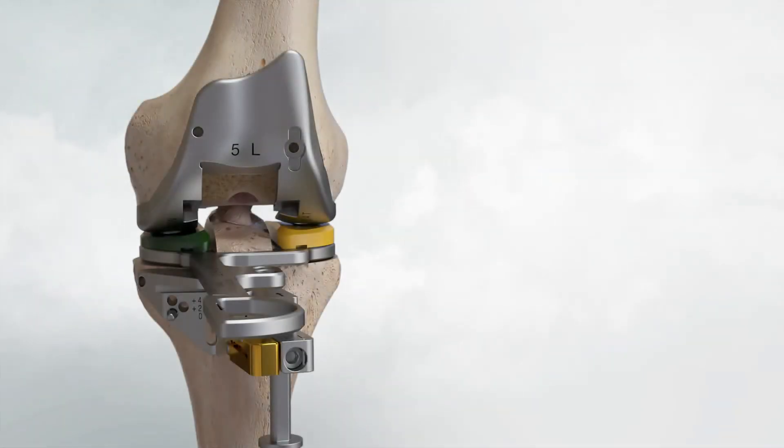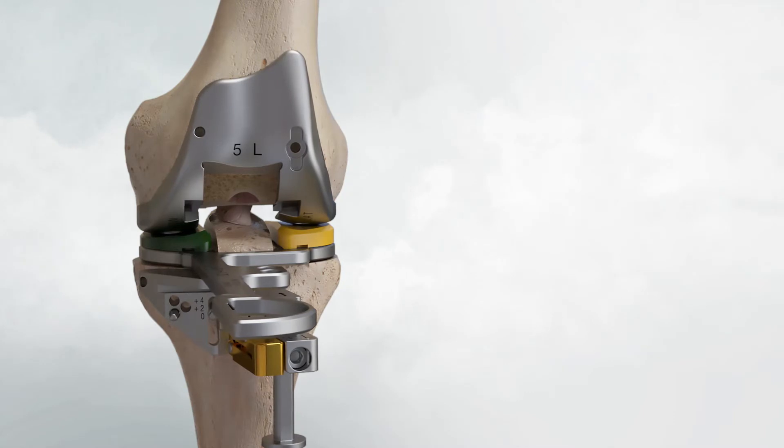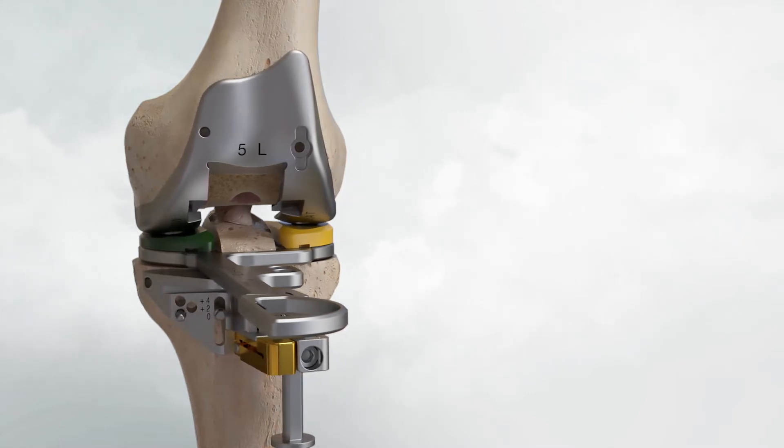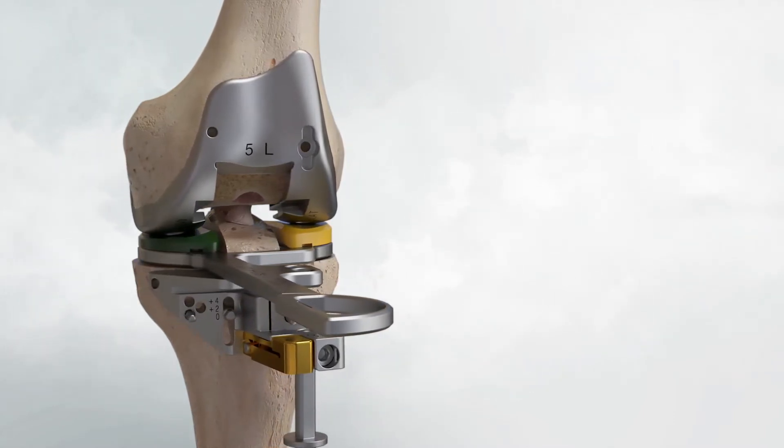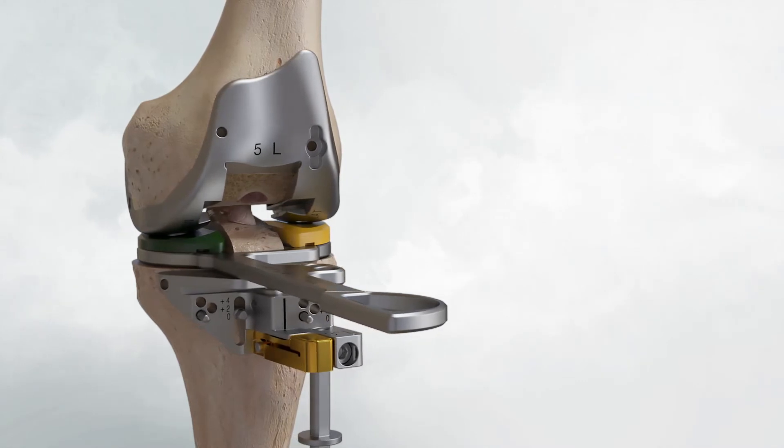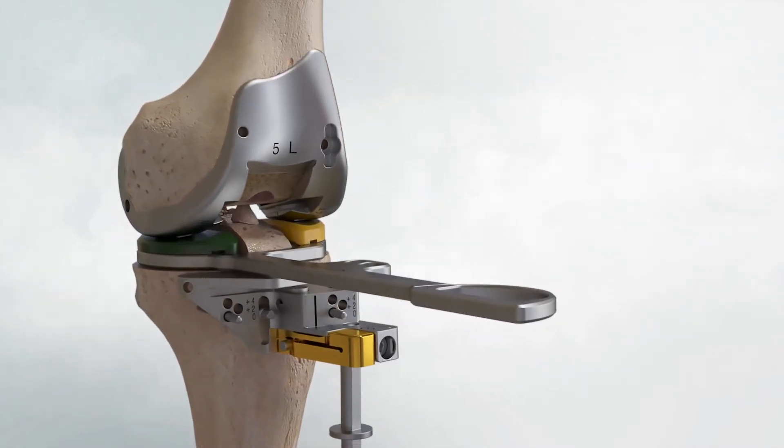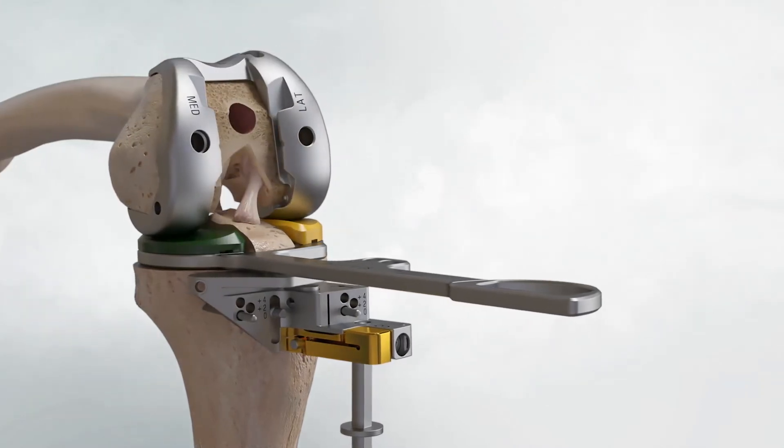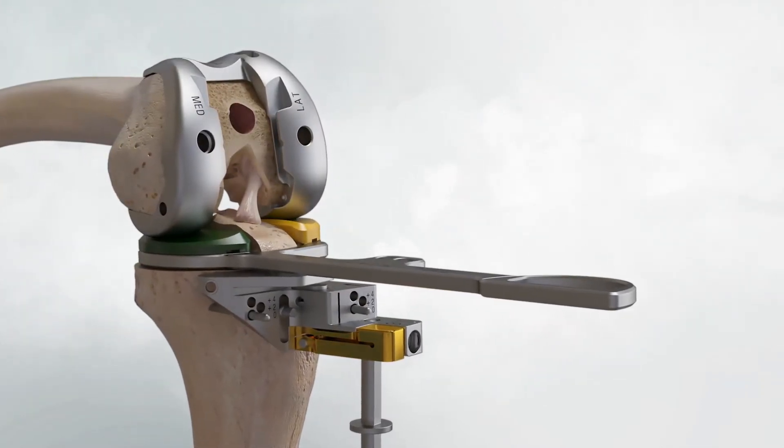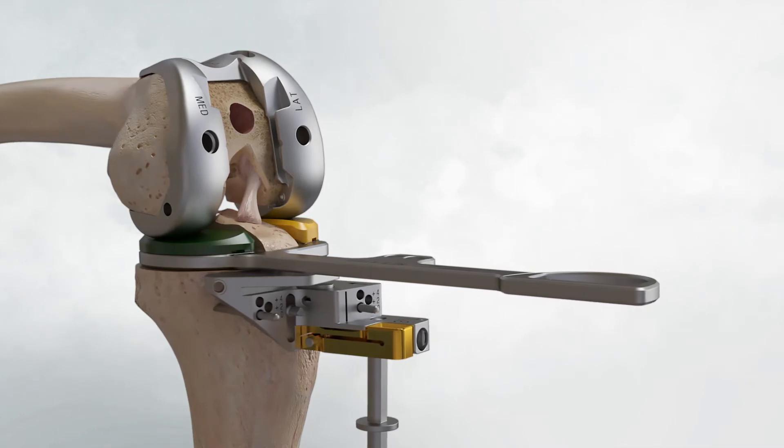Select the full insert trial option that provided optimal medial balance. Gauge and ensure 1-2 mm of medial and lateral extension laxity. Gauge and ensure 1-2 mm of medial flexion laxity. Lateral flexion laxity may be greater, but a minimum of 1-2 mm is suggested.